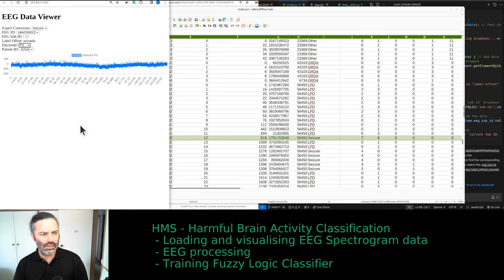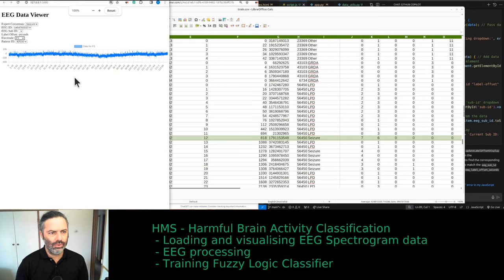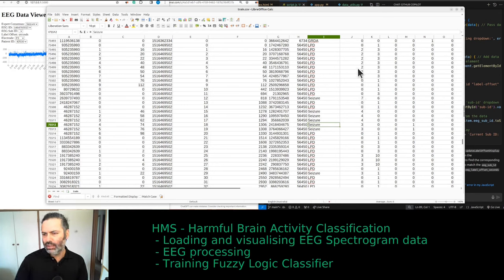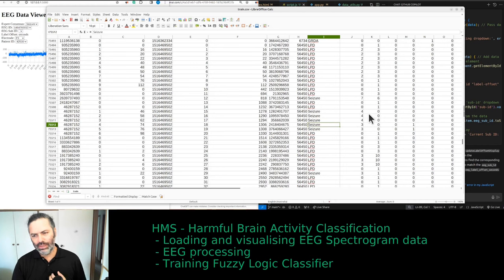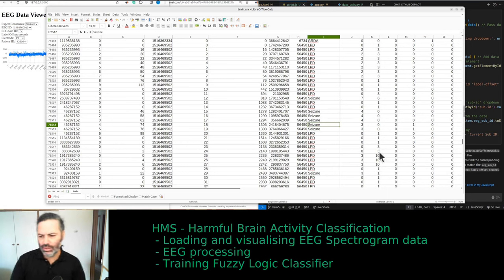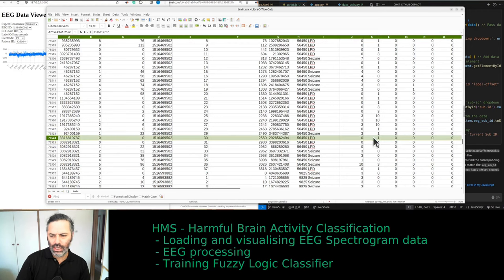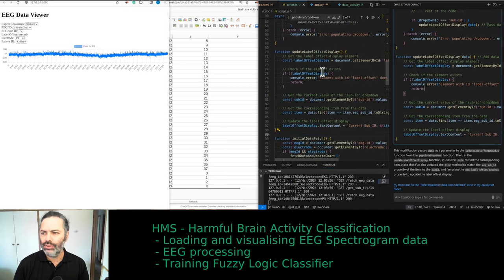That one actually looks like a seizure with some of the spiking. We want to pull out seizures that had a very high agreement and a large number of experts — those will be the priority parameters. There's actually a kappa score that tells you something about the agreement level between experts. We'll go from there. This one was only labeled by one expert, which is a bit odd.